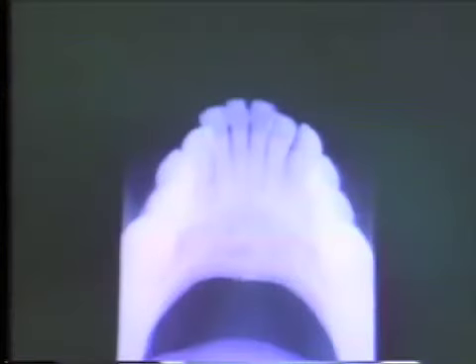This is an excellent example of a mandibular anterior occlusal radiograph. The incisors are shown at approximate anatomical size and length. The remaining bone to the lower border of the mandible is well visualized. It is a very useful film for demonstrating impacted teeth or pathologic lesions in the area.